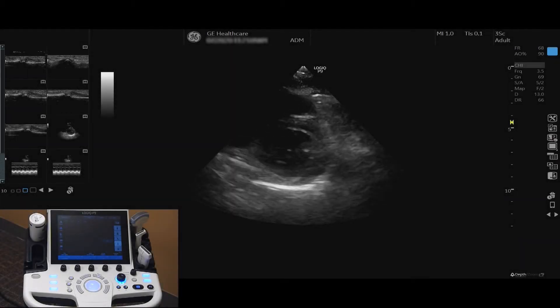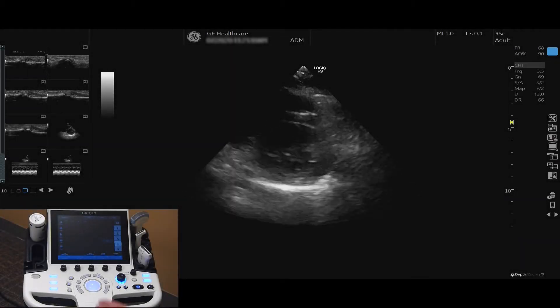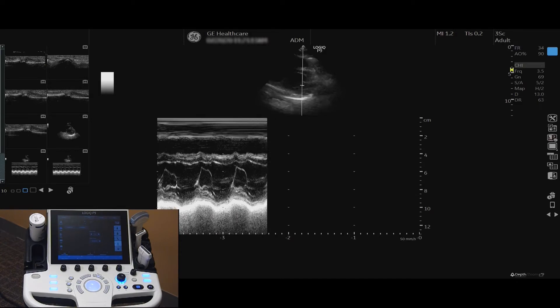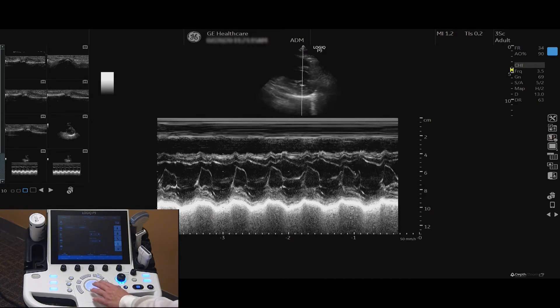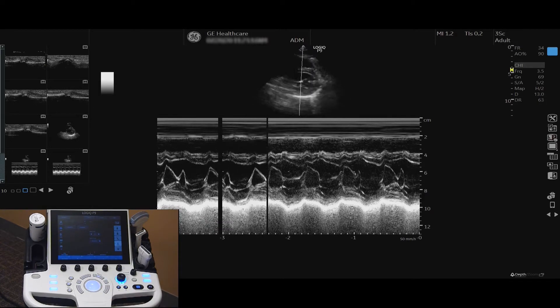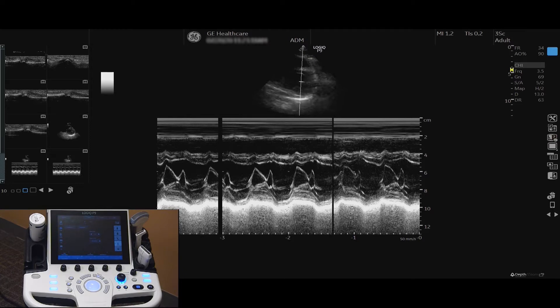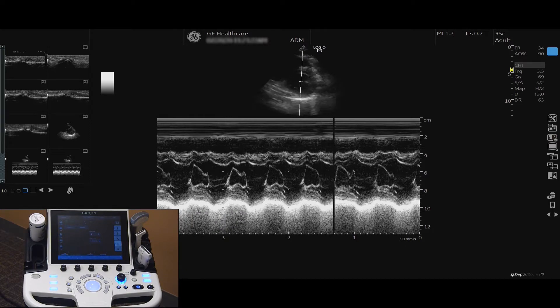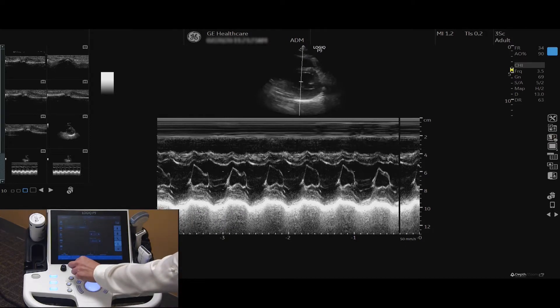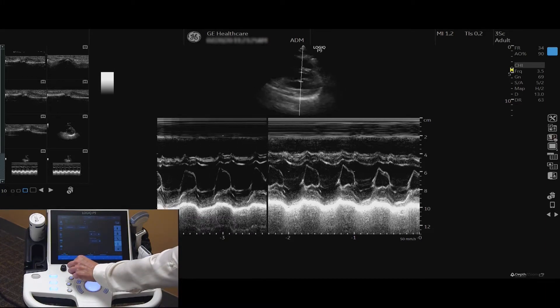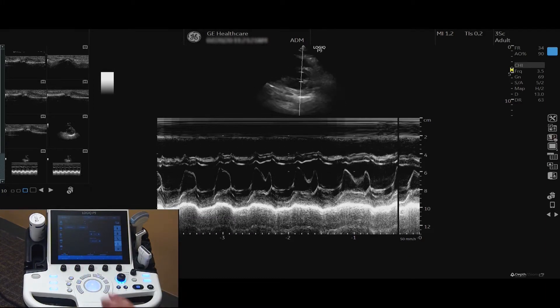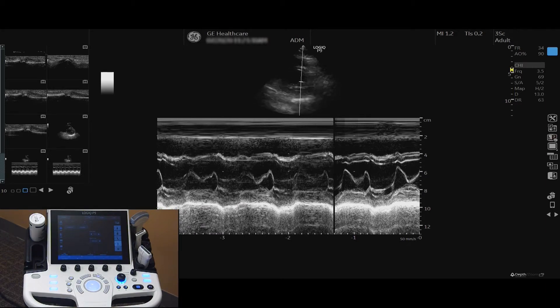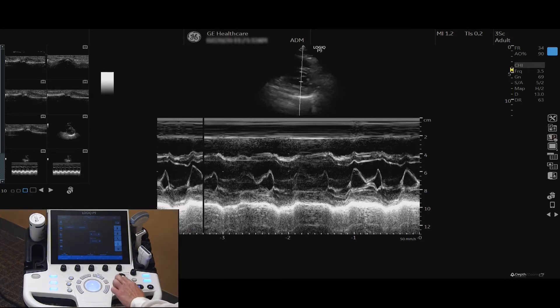To activate motion mode, press the M rotary button. Use your trackball to move the location of the cursor. Increase and decrease the M mode brightness by turning the M rotary button. To deactivate, press the M button or press the B button.